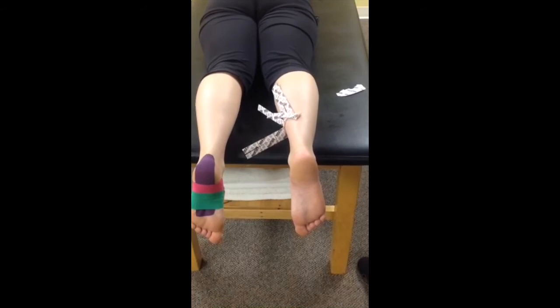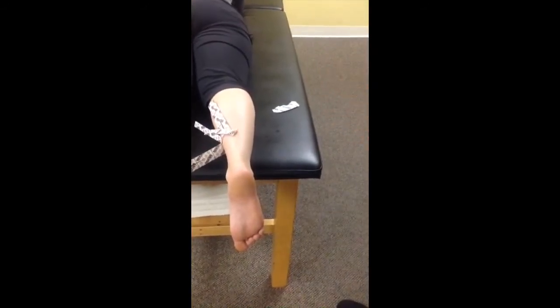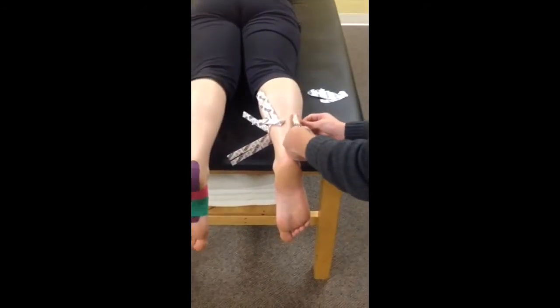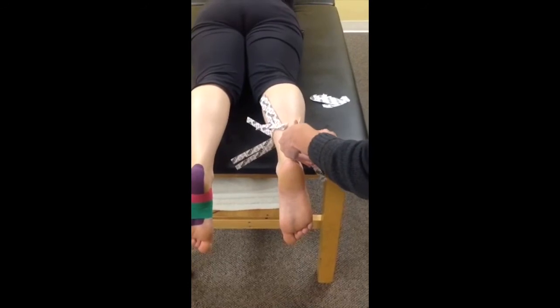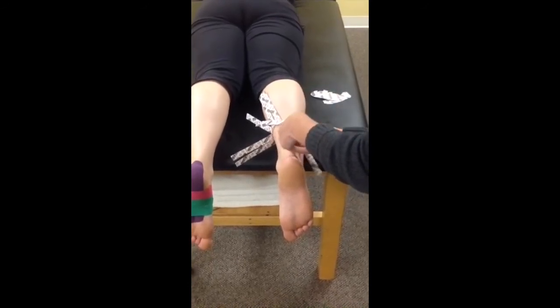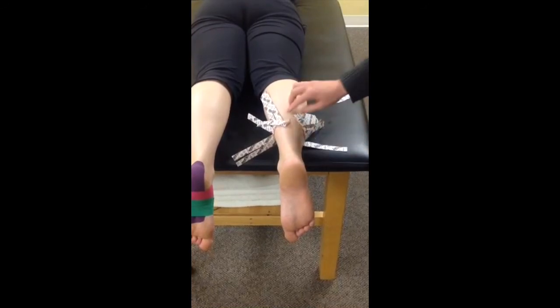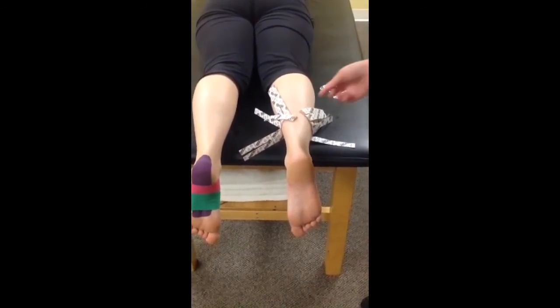So then we're going to rip the ends here and I'm going to anchor here. All you're going to do is you're actually going to kind of basket weave this tape.